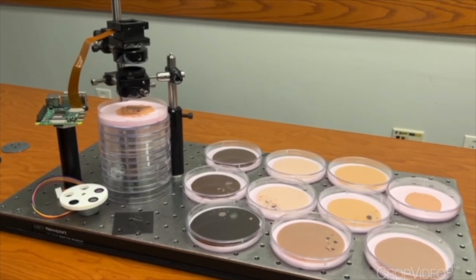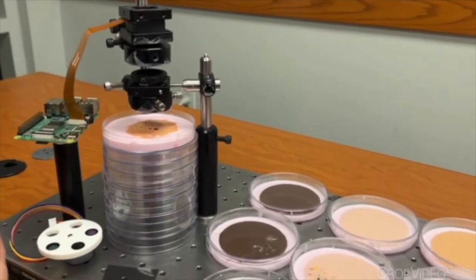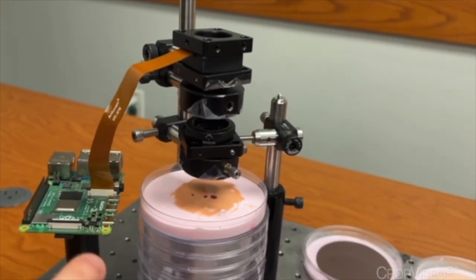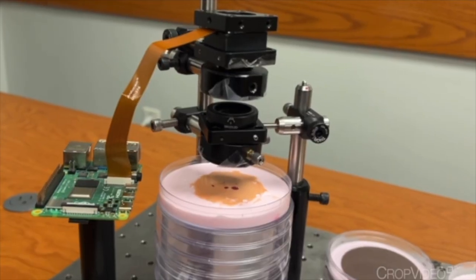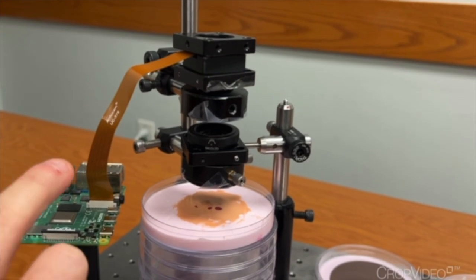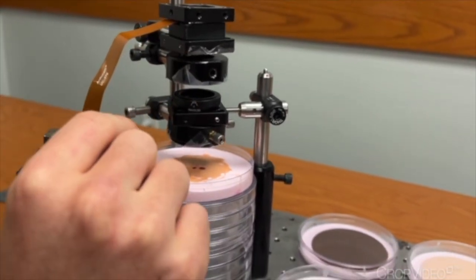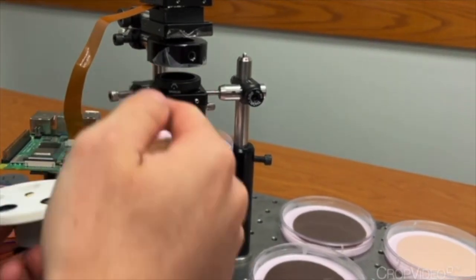Okay, so as shown in the 3D printing section, this is our optical stack. I'm going to go through component by component and let you know the setup. So starting with the sample, we then have our infinity corrected lens system using two achromatic doublet lenses. The first being a 5mm lens with a 12.5mm focal length, and the second lens is encased right here, which has a 25mm focal length. And it's infinity corrected because the space in between the two lenses is equal to the sum of the two focal lengths.